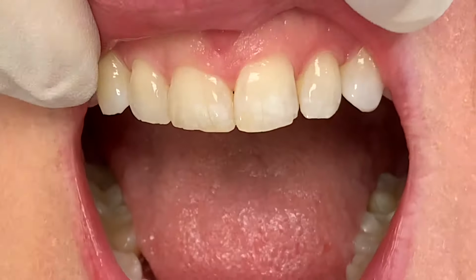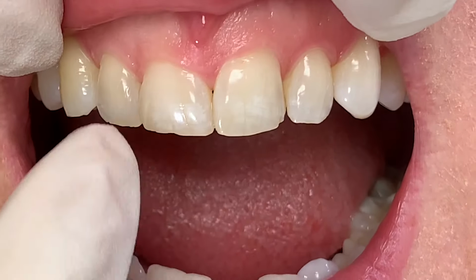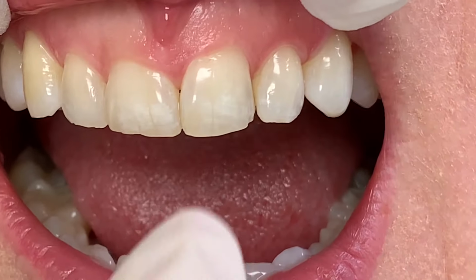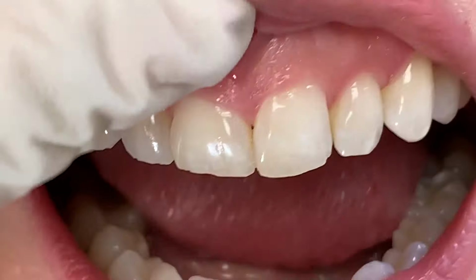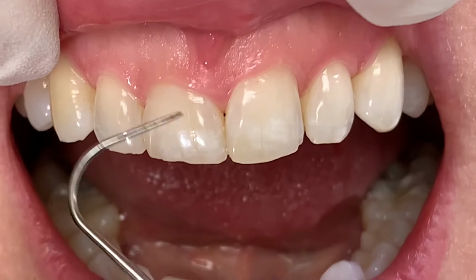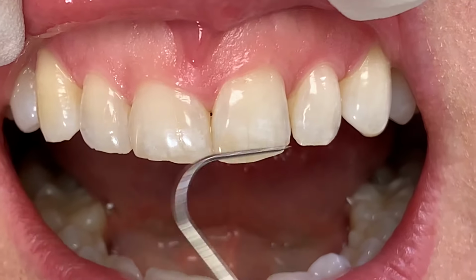Open, please. If you notice, this patient has nice teeth, but the two front teeth are a little bit worn down. They should be a little bit longer than the teeth on either side. But the main thing I notice when she smiles is that the gum height of this central is higher than the gum height of this central. So what we're going to do is use our Biolase laser, and we're going to remove this gum tissue, and maybe a little bit here, to make it more symmetrical. So let's get started.